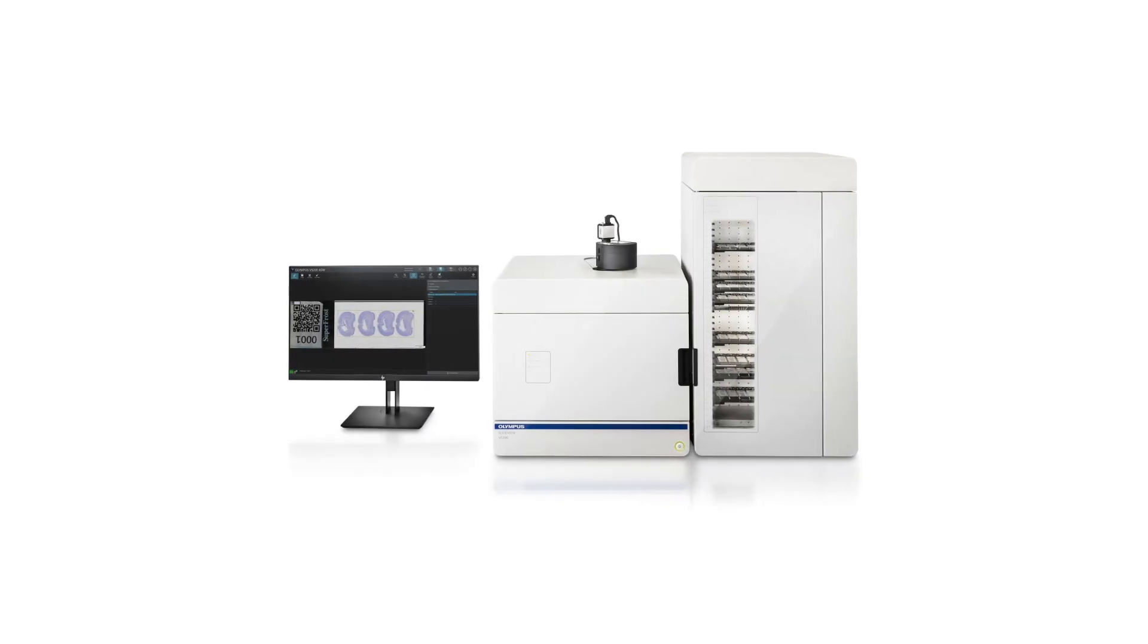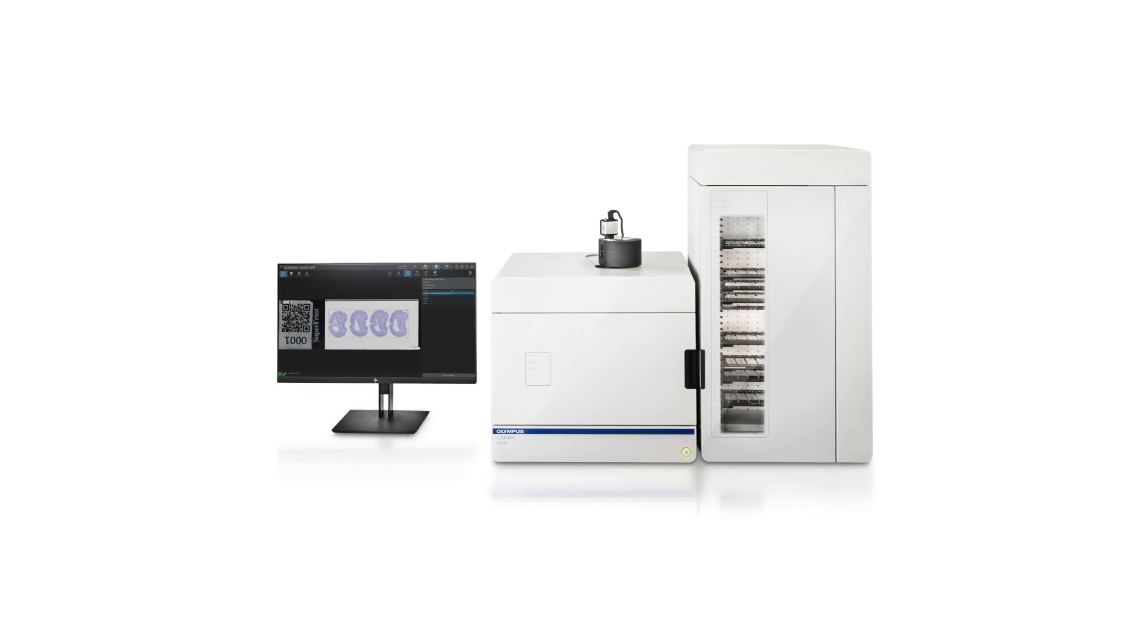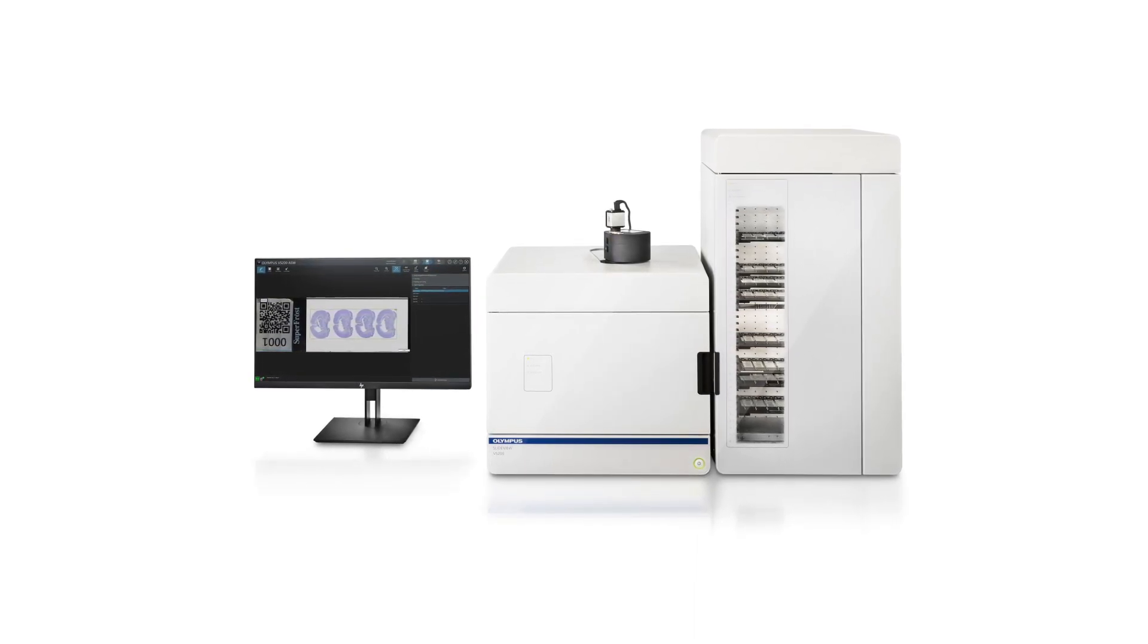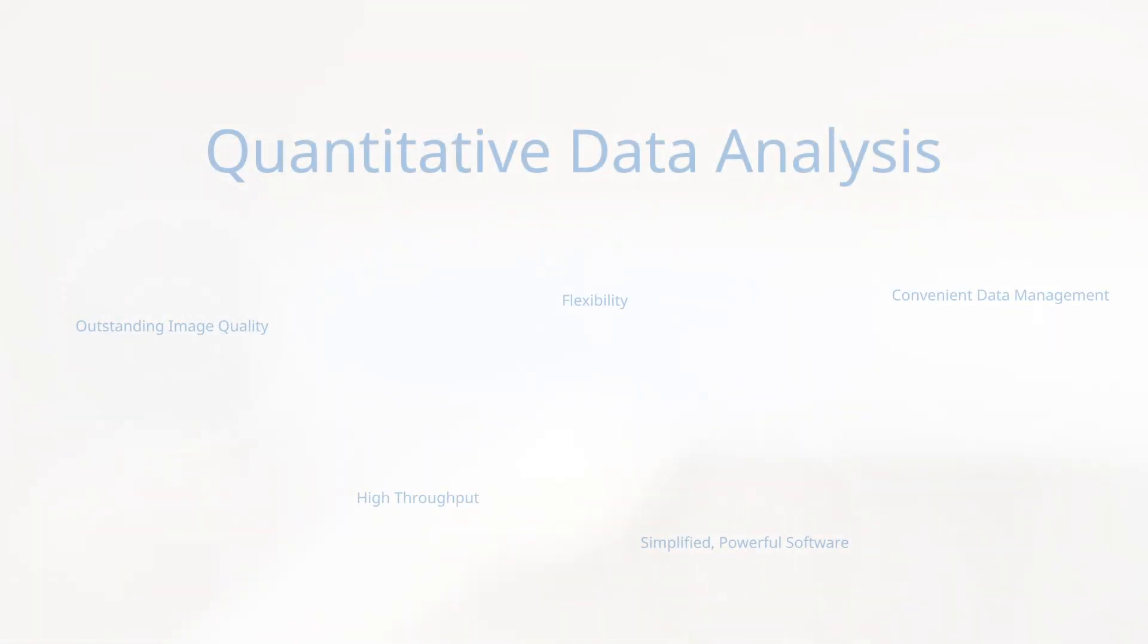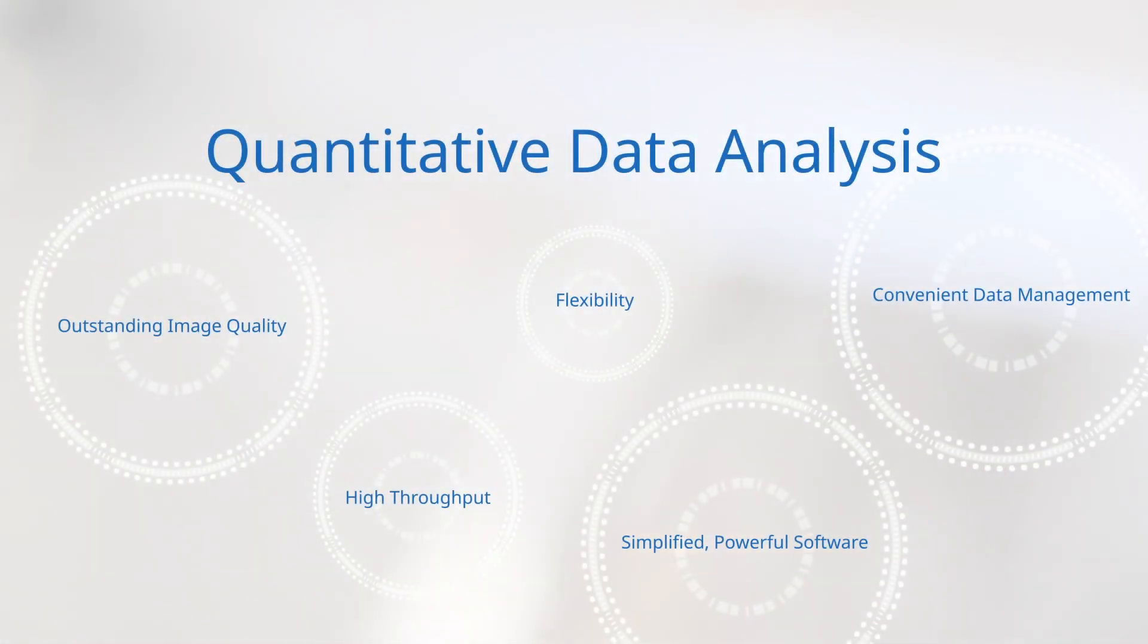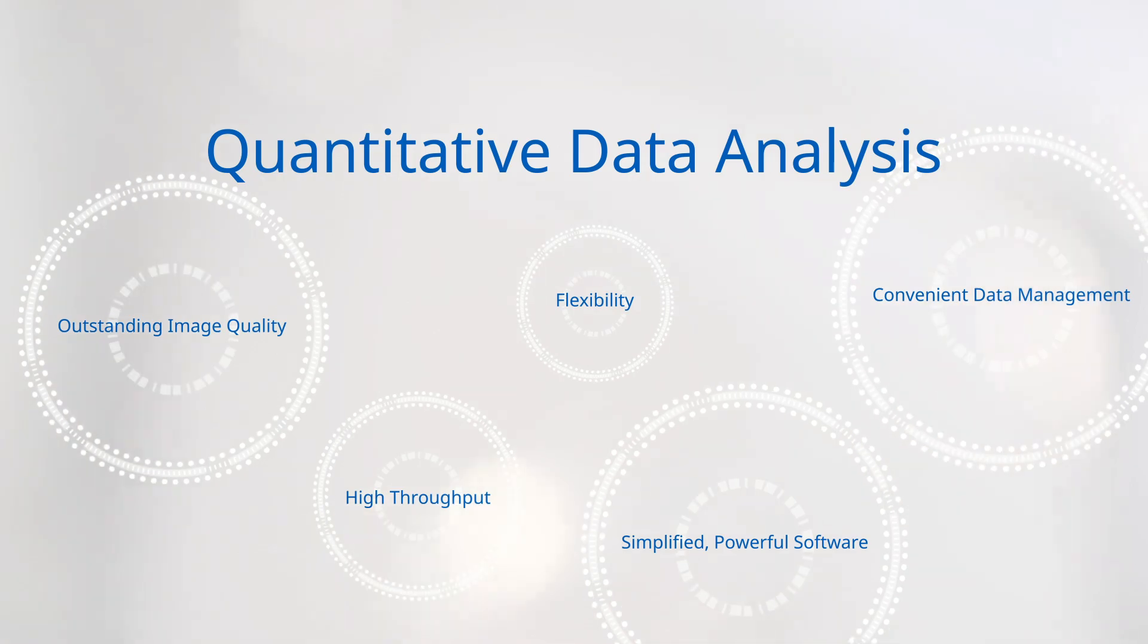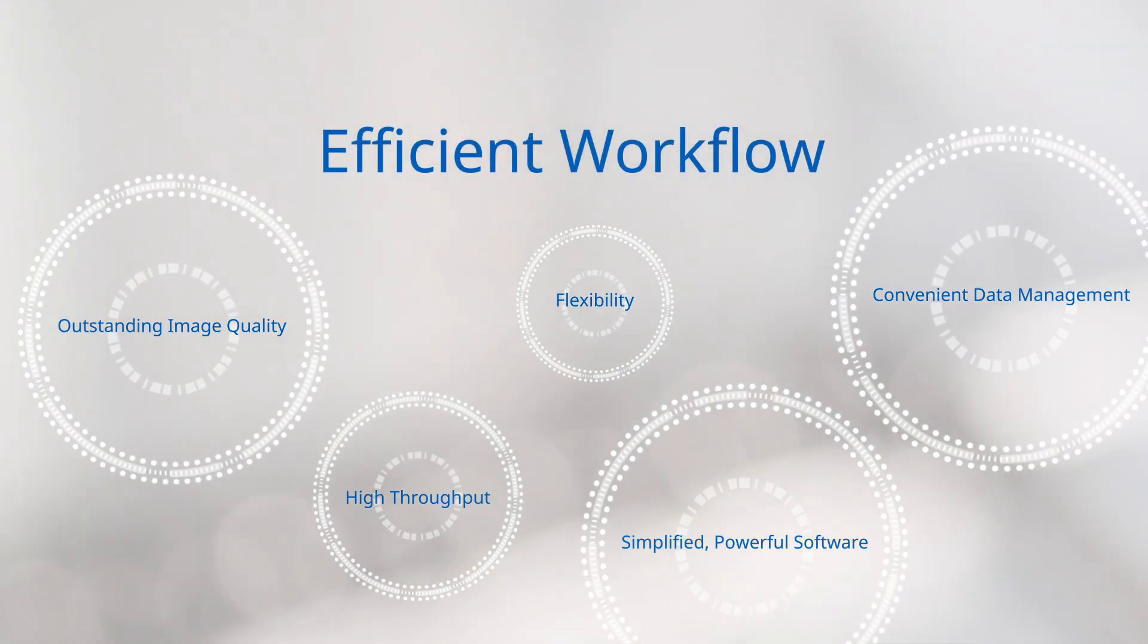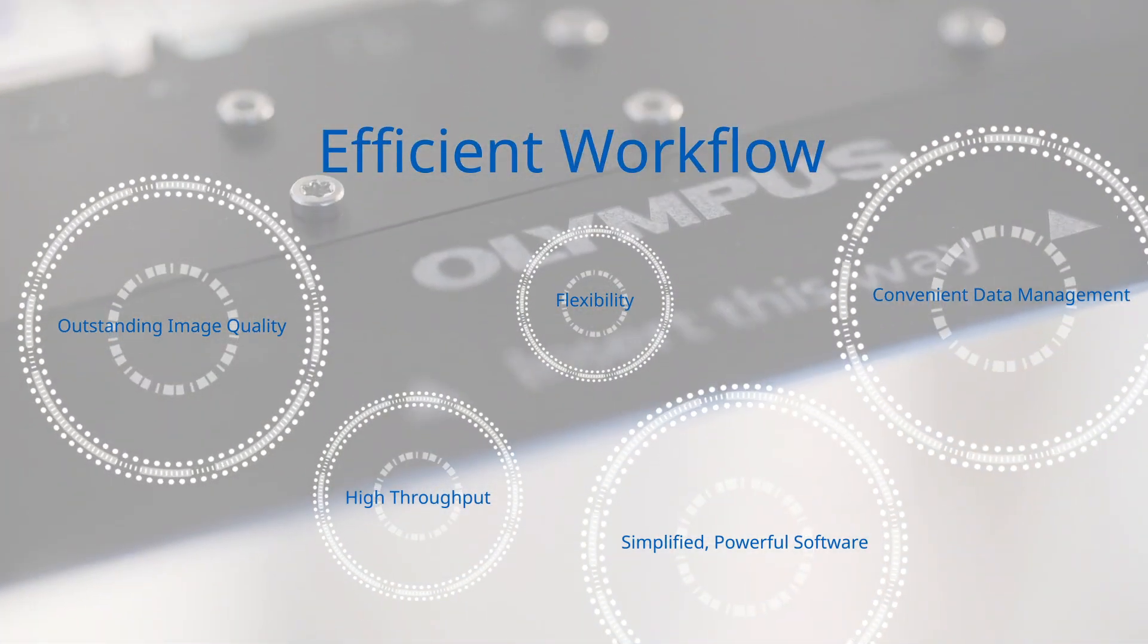The SlideView VS-200 system provides reliable virtual slide images for quantitative data analysis and improves the efficiency of your experiment workflow.